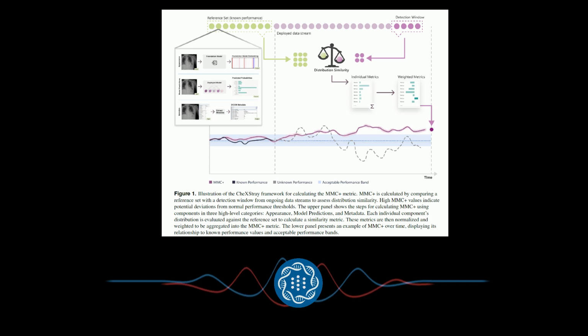This really interesting example, the COVID-19 pandemic and its impact on an AI system at Massachusetts General Hospital. Oh, wow. So this AI was analyzing chest x-rays, and when the pandemic hit, things got really interesting. I bet. They mentioned something in the paper about even the types of x-rays they were taking changing. Absolutely. Before the pandemic, only about 20% of chest x-rays were taken from a certain angle. It's called anteroposterior, or AP. Okay. But during the pandemic, that number jumped to 40%. Wow, that's a huge difference. It is. And it turns out the way a patient is positioned can have a big impact on these systems.